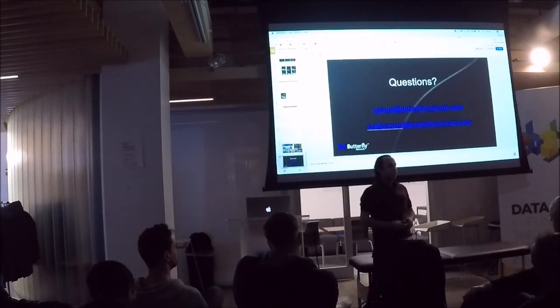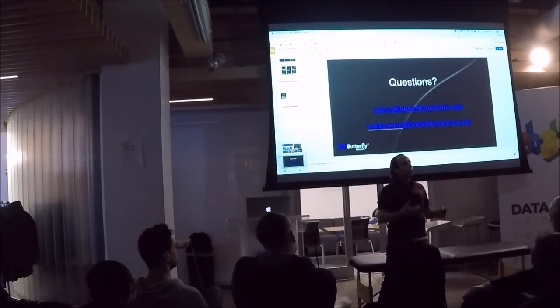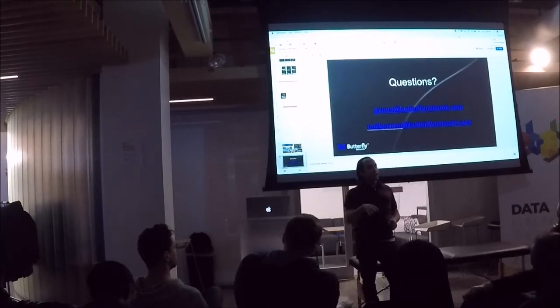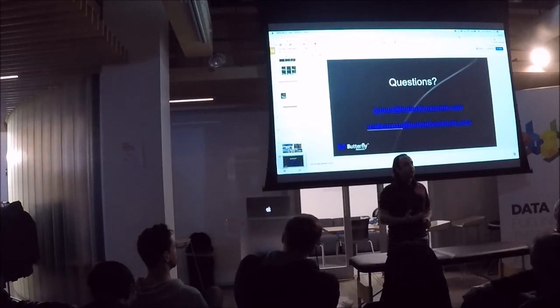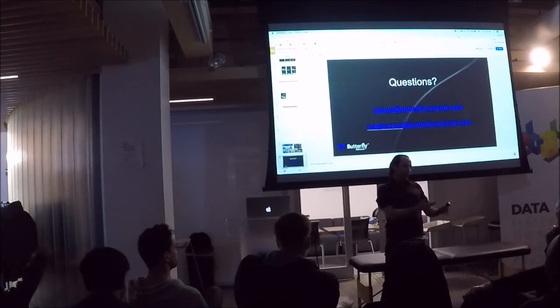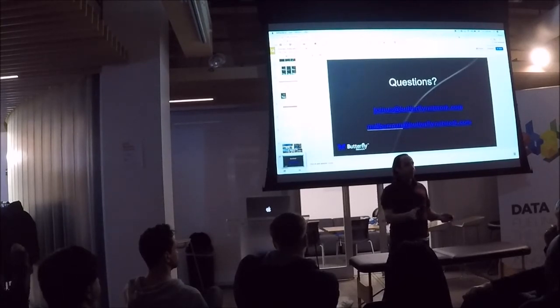The second thing is, it's true, interpretation is very important. People do sometimes get worried that they can't understand exactly why a network is making the prediction that it's making, and that's another one of the areas that we're very interested in working on: really trying to show a clinician exactly why the algorithm is making a particular decision. That quality indicator is maybe the weakest version of this, which is like, how confident are we in that prediction? But as you might imagine, there are many cases where you really want a much better sense of exactly why the network is making a particular interpretation, so that the clinician can look at it and understand, well, that makes perfect sense. You've provided the evidence for me, I'm convinced.